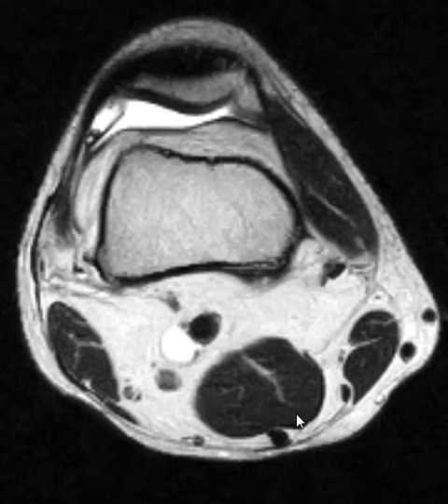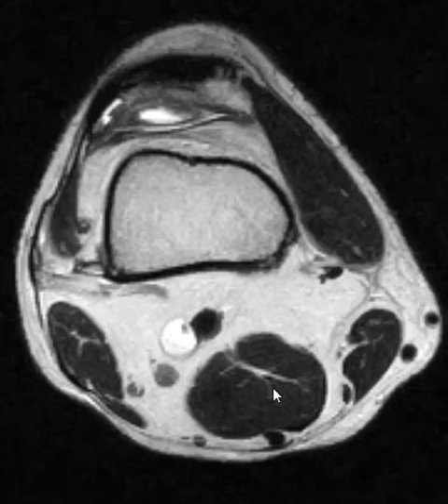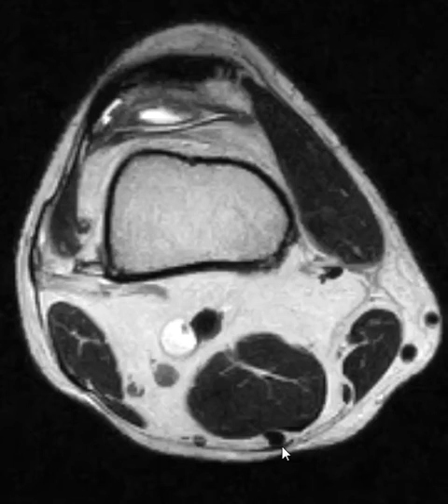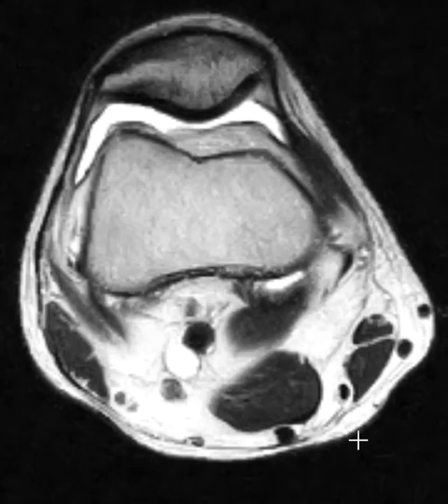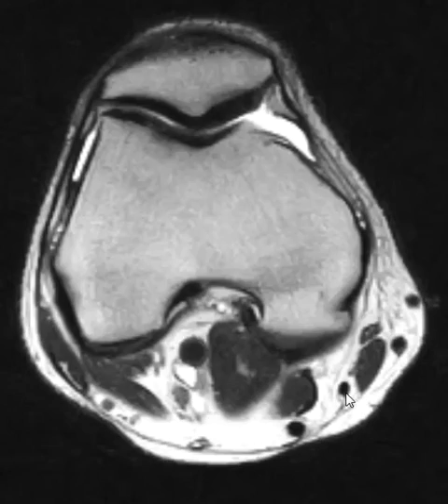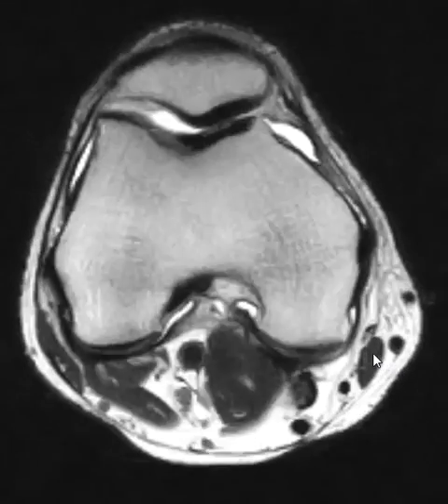Now, behind the semimembranosis, it's easy to identify the next PES-anserine tendon — this is the semitendinosus. The semimembranosis and semitendinosus sound similar and are intimately related; they come off the ischial tuberosity right next to each other, so it makes sense they'd be together down here. Here is the semitendinosus, and the next one over is the gracilis tendon.